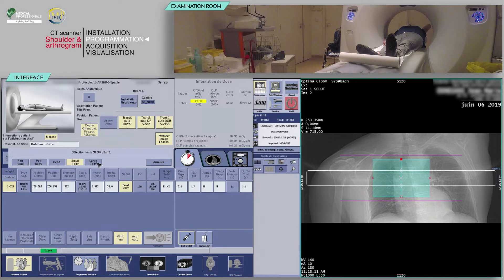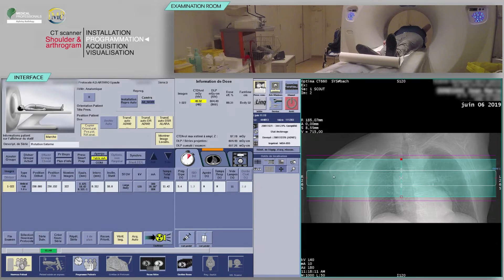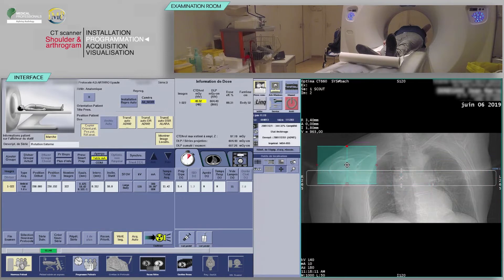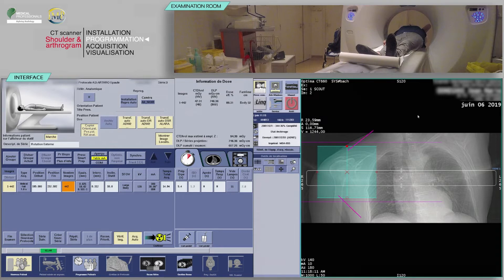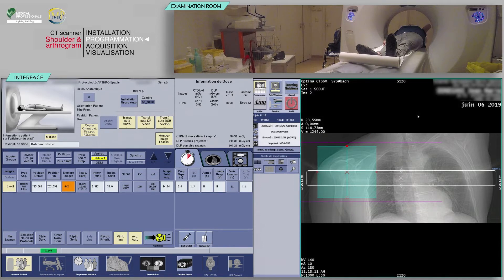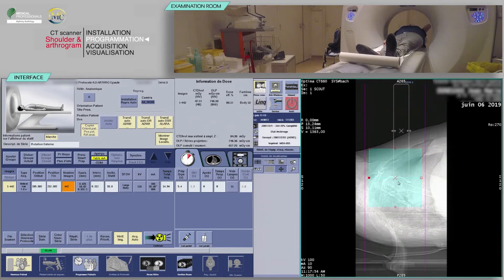Verify that the selected scan field is wide enough to cover the entire shoulder. Place your slices box on the AP localizer in such a way as to cover the shoulder from the upper edge of the clavicle superiorly to the upper third or proximal third of the humerus inferiorly. Then check to cover the entire shoulder on the lateral scout view.